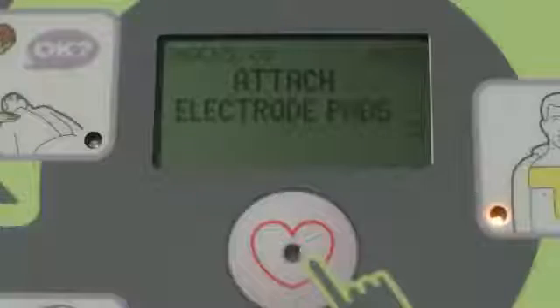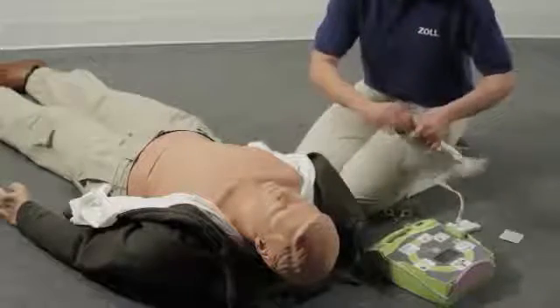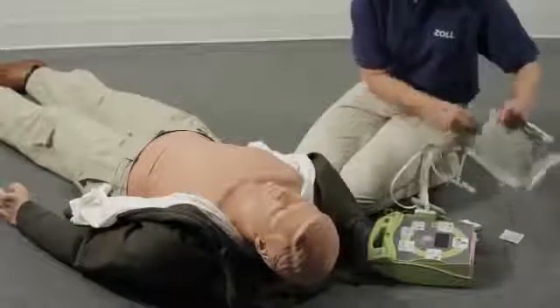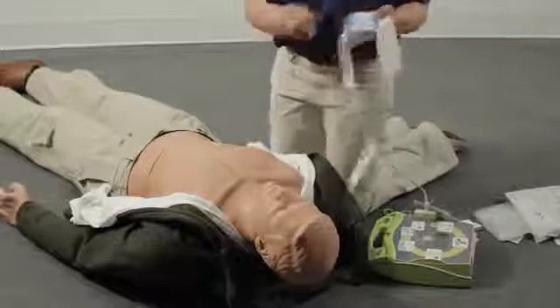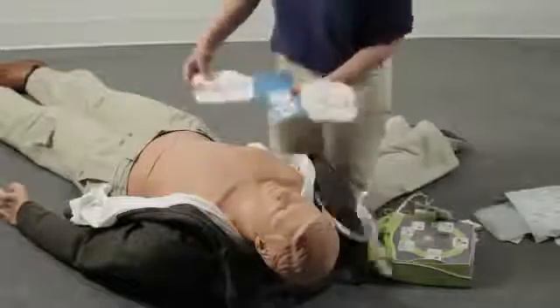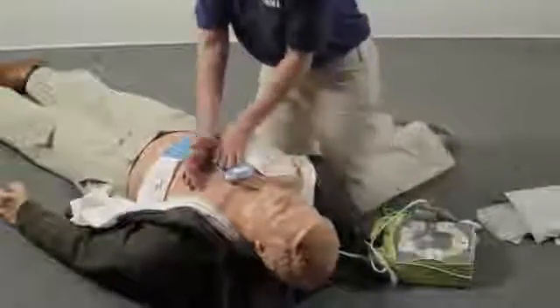Attach defib pads to patient's bare chest. Dry the chest if necessary and quickly shave it if there is heavy chest hair.